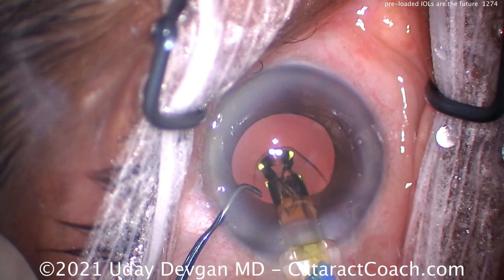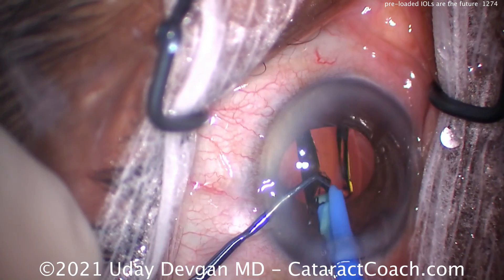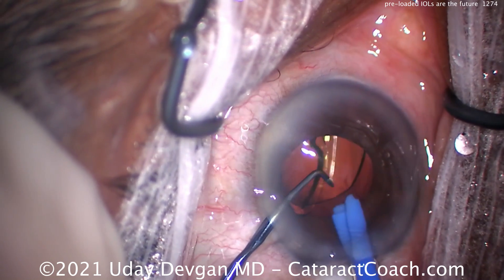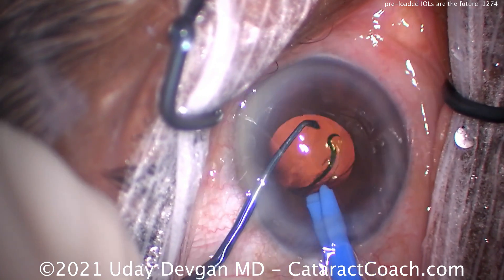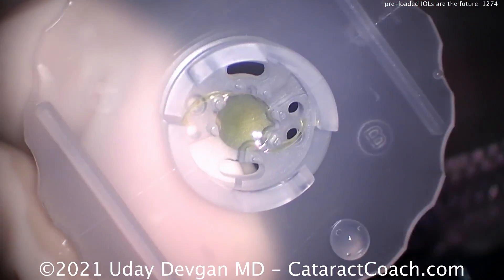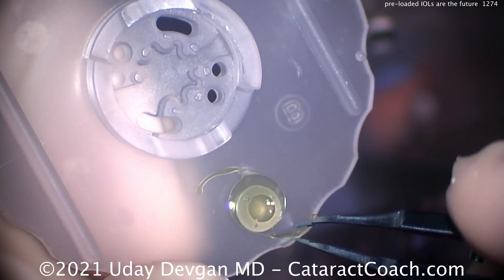With these new injectors you have a higher degree of being able to deliver it accurately the first time. I've probably done coming on a hundred of these and I've had zero that came out misloaded — zero issues at all. I think the manufacturers are doing a great job in delivering these products to us.